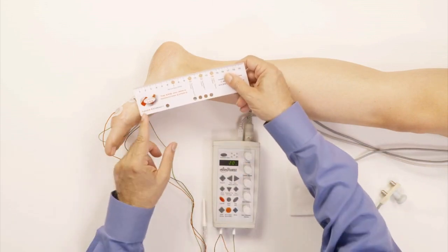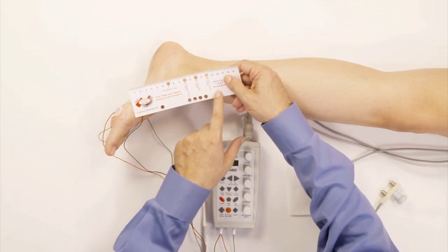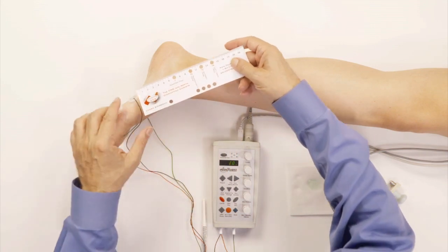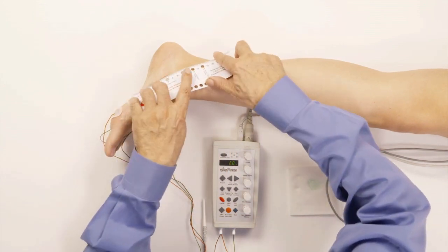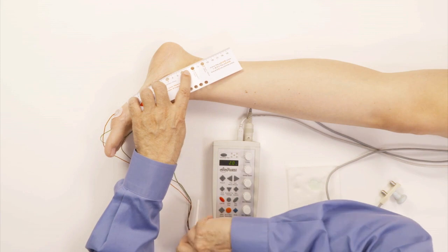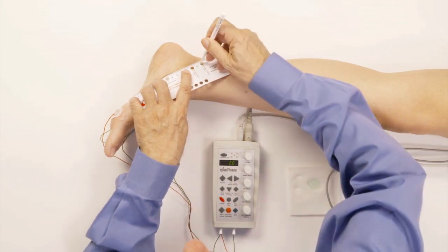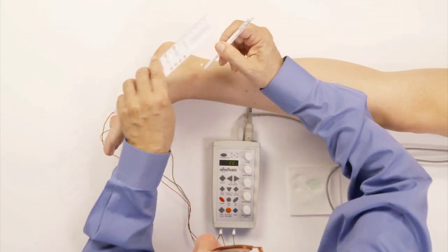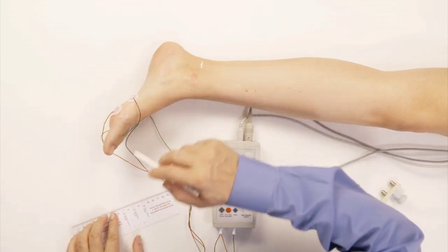We're going to measure the distance from here to behind the ankle. It should be 14 centimeters. Here's the ruler. It shows that the tibial motor here is 14 centimeters. I take the marker and put the marker right in that hole. That's where I will stimulate the tibial nerve.